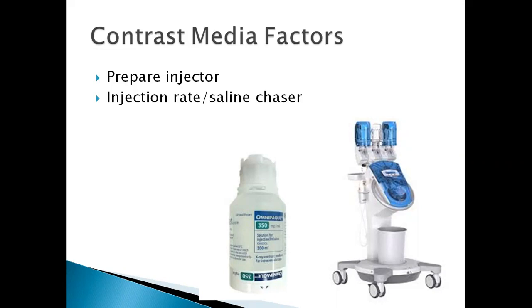Remember, the patient already came to your department. So you weigh them and you know how much they weigh. You must decide now how much injection rate you're going to give based on that. Make sure that your injector is working well.